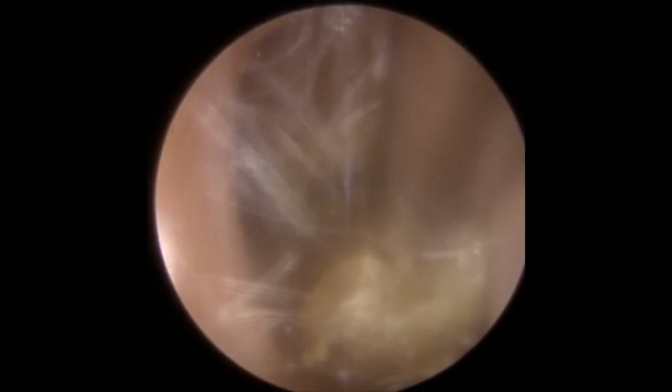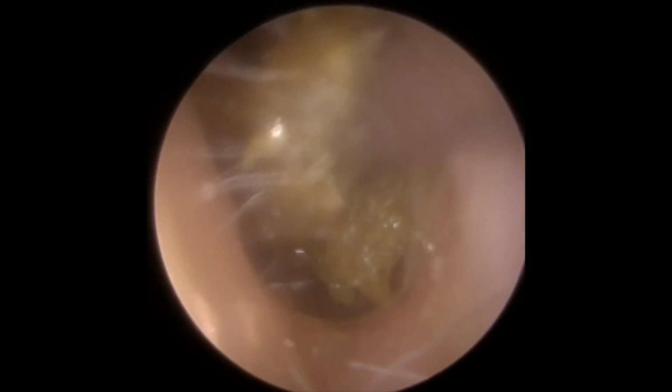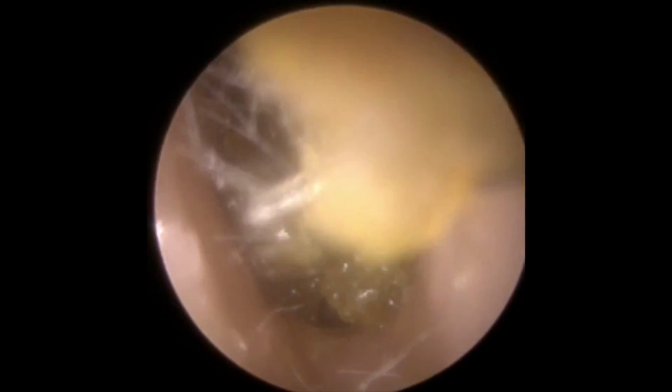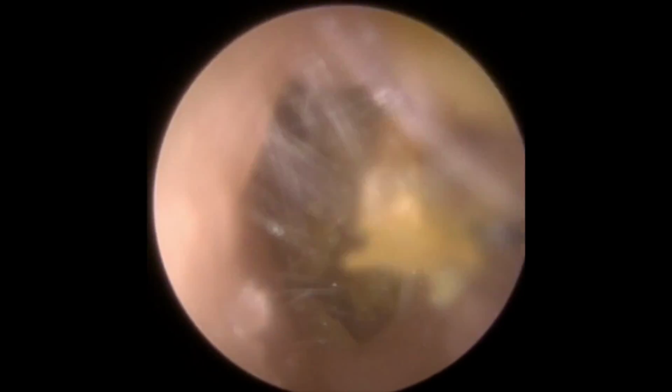So I'm just going to use the fine end again now to spin. We can see we've got a slightly different shape now to this wax. Still too big to fit out of the canal, but more effective for getting the grip on with the crocodile forceps. So I've just got a grip there, just going to pull. You can see it's brittle, it's breaking away, it's not pulling out of the canal yet. Back in with the forceps again. You can see we've inadvertently just bumped it a little bit there, so it's moved again.